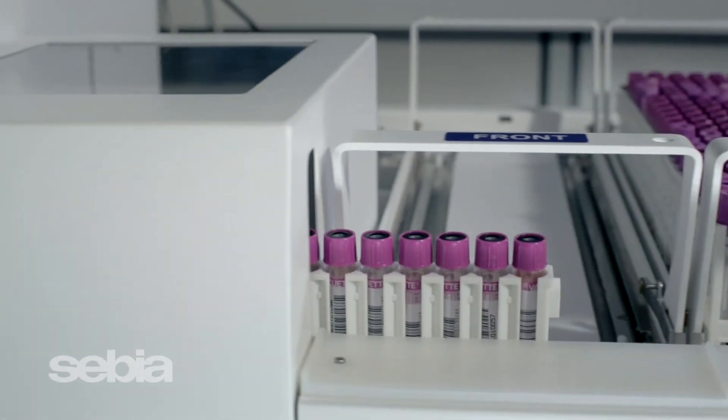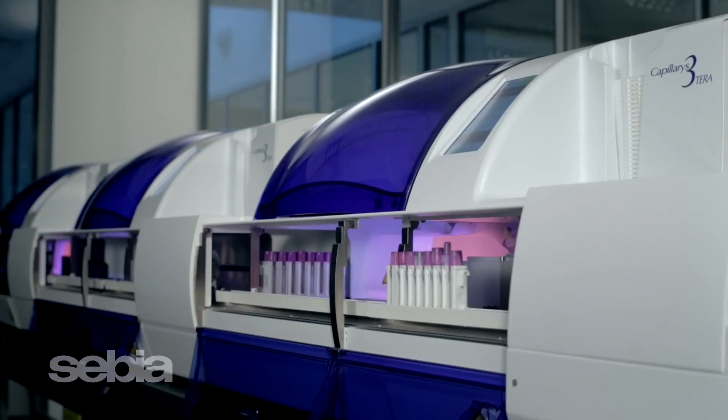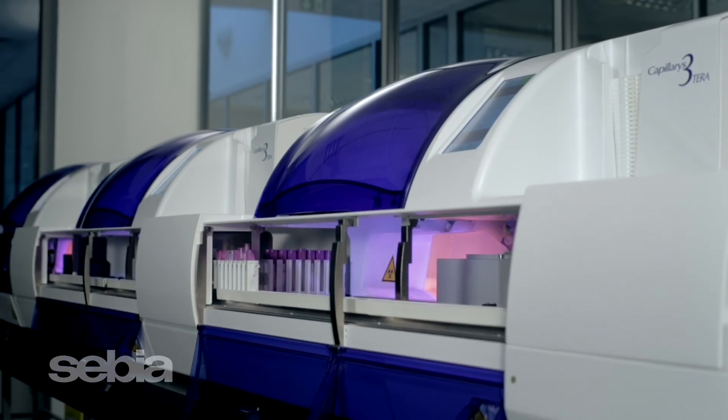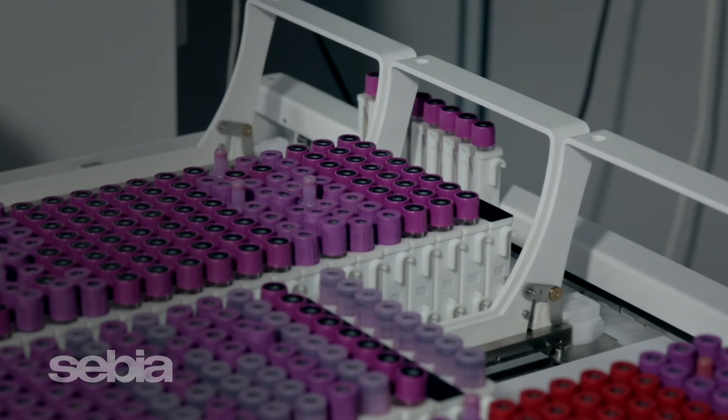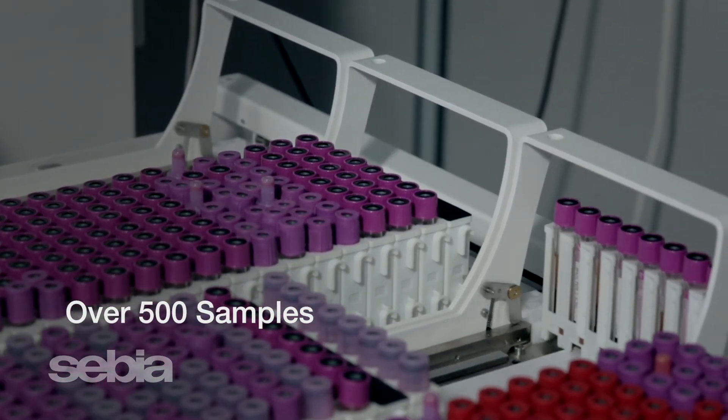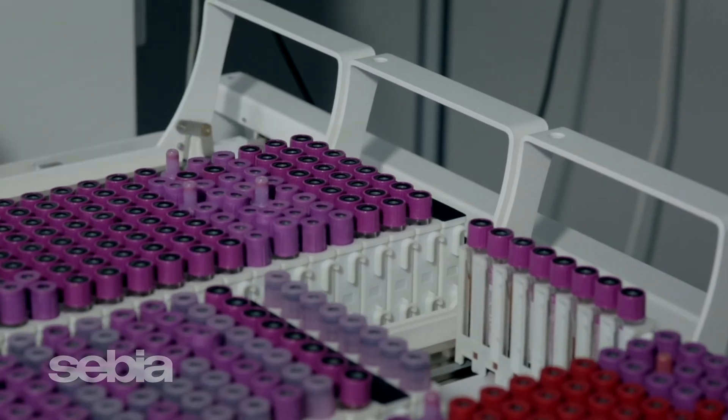The Capillaris 3 is adaptable for any size lab. For maximum efficiency in the high-volume lab, connect one, two, or three Capillaris 3 systems with our tube loader. The tube loader can load over 500 samples at a time and provide continuous sample processing to meet your laboratory's workflow.